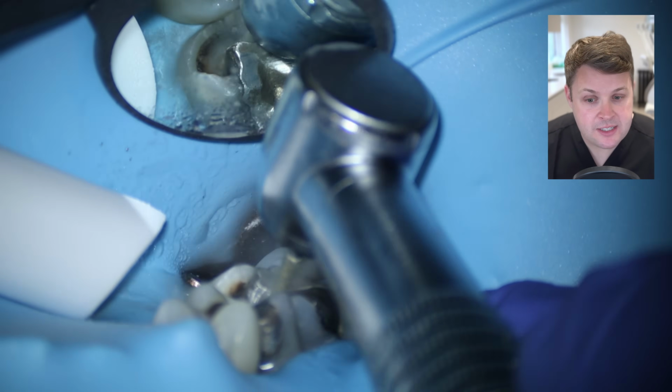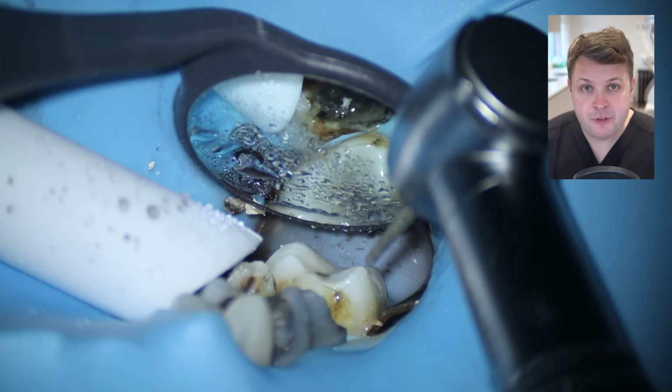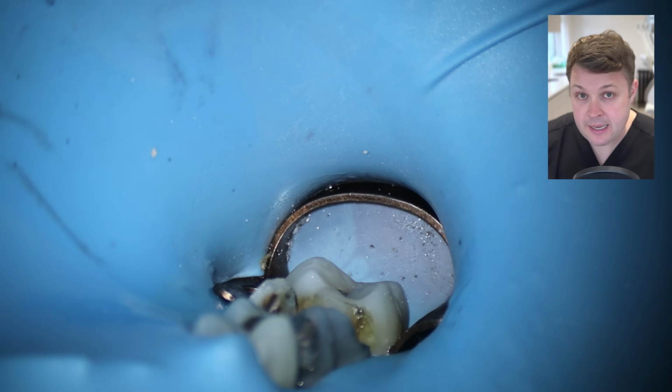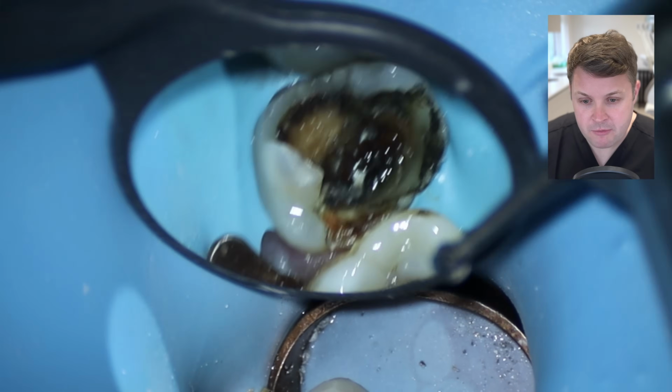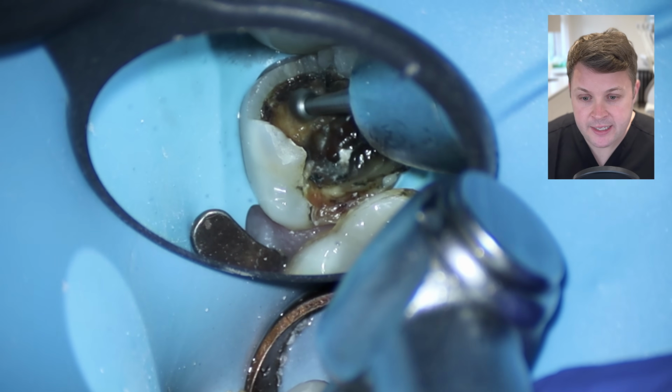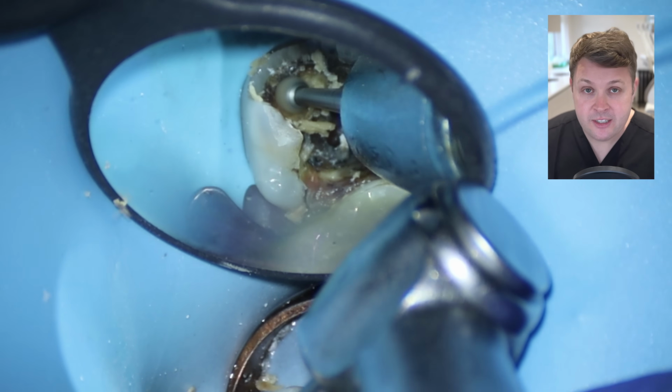You know, the restorability is not obvious in this case, but once we remove the restoration, I feel like the contact point between the rubber dam and the tooth isn't great, so I'm just going to floss that down, and then I'm going to pick up my slow handpiece, my rose head, just to remove most of the decay. And in this case, I'm not worried about the pulp because I know the pulp's dead, so I'm just going to really give it a good clean out.